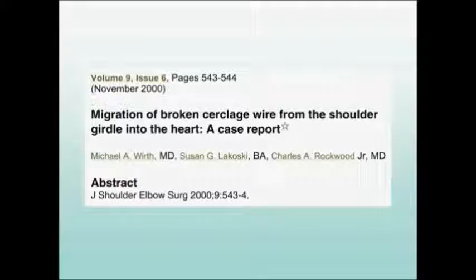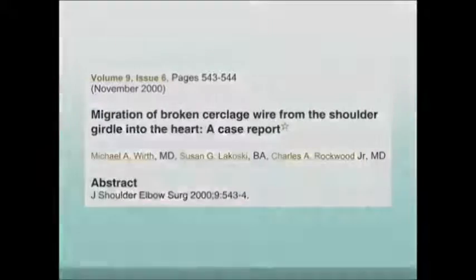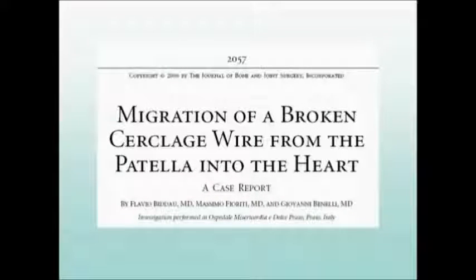The problems of debris migration are not eliminated with the use of monofilament wire. There have been at least two case reports in the literature of broken fragments of orthopedic cerclage wire migrating into the patient's heart.